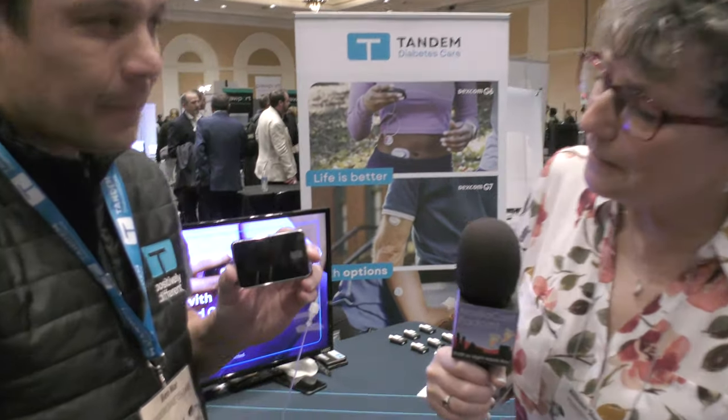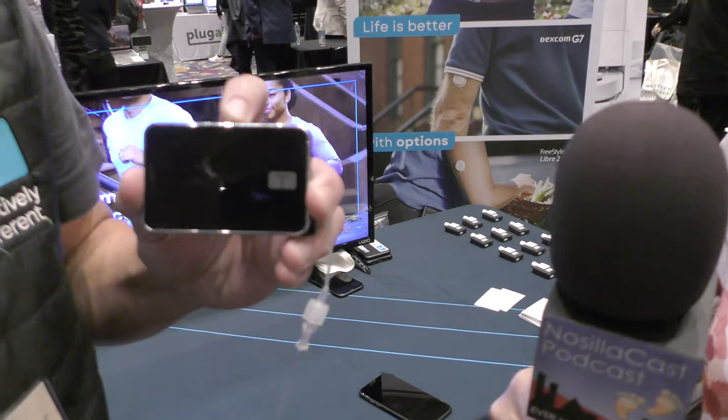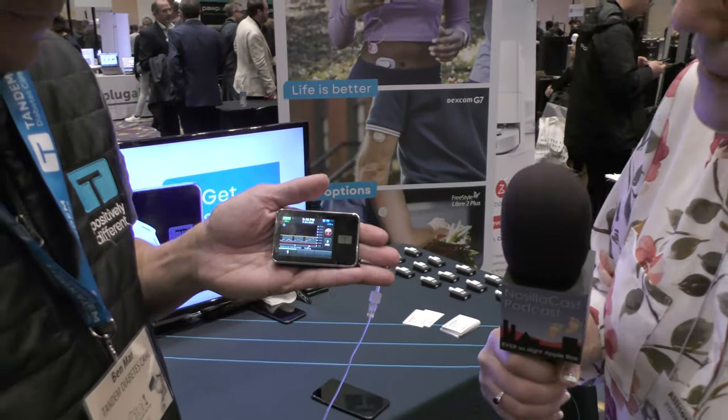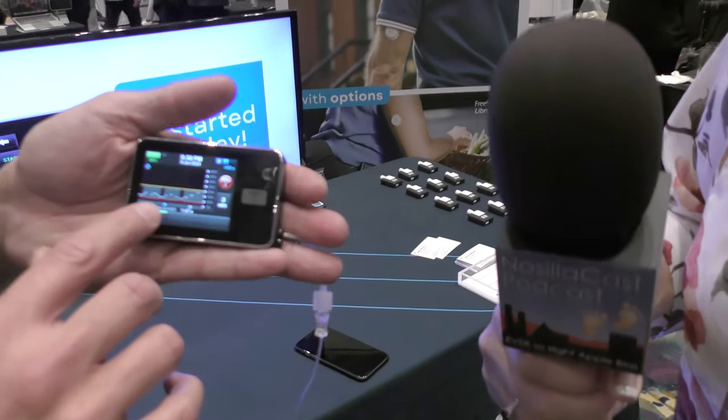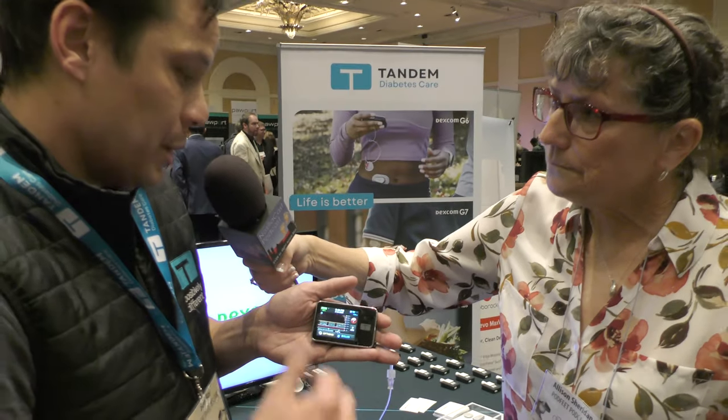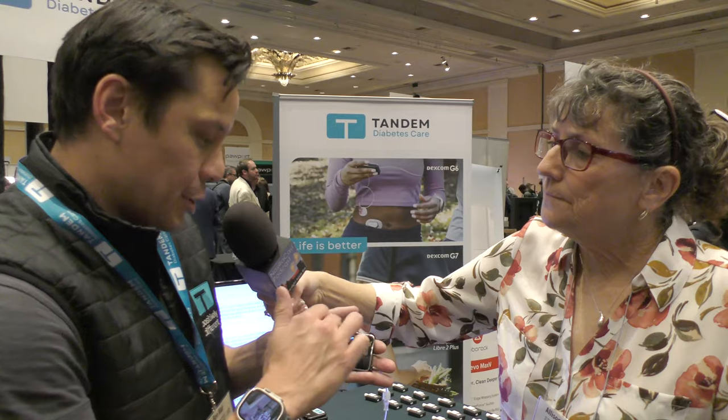An insulin pump essentially delivers insulin to those with diabetes. You've got a tiny little unit in your hand — it's got a display on it, smaller than half the size of a deck of cards. It's actually monitoring your insulin, your continuous glucose monitor, your blood sugars, showing you the history of that and the history of the adjustments the pump has been making over time to keep you in range.